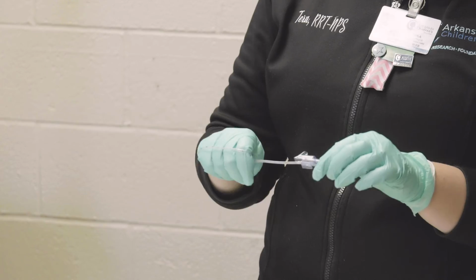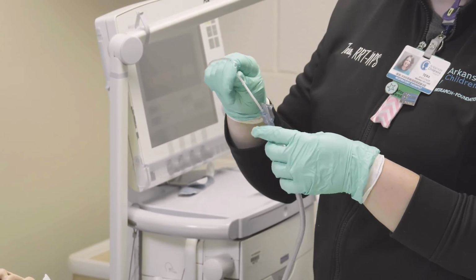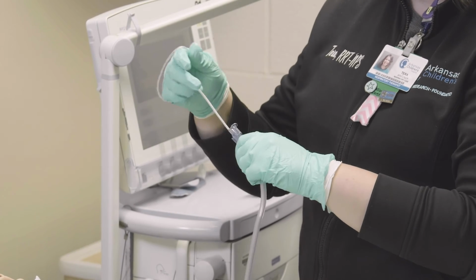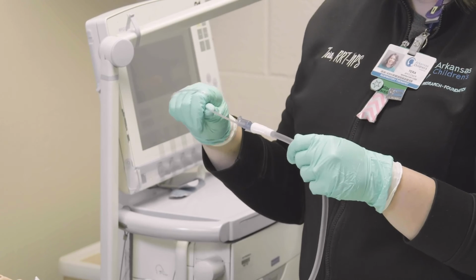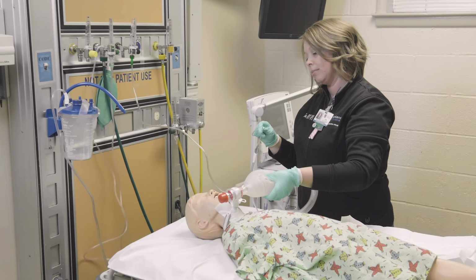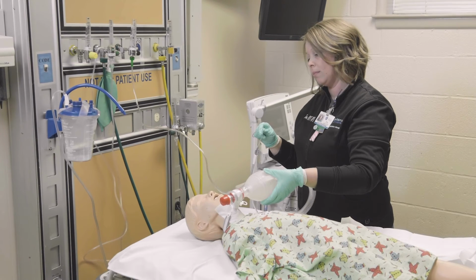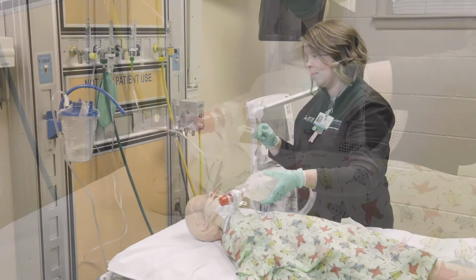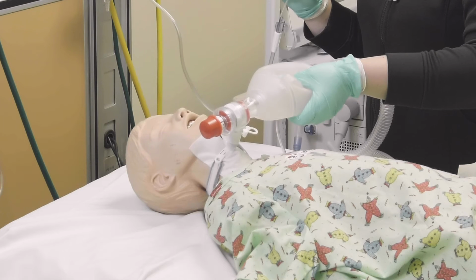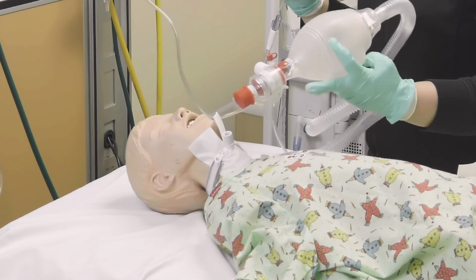Coil or wrap the suction catheter around the dominant hand. Using the non-dominant hand, pick up the suction connection tubing and connect it to the suction catheter. If indicated, pre-oxygenate the child using the ventilator or self-inflating bag with 100% oxygen for between 30 and 60 seconds. Disconnect the child from the ventilator circuit with the non-dominant hand or instruct an assistant to disconnect the child if clinically indicated.